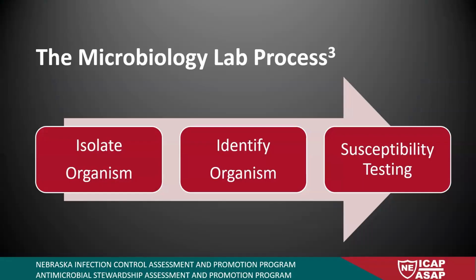So the very first thing I would recommend, if you have a chance, is to go into a microbiology lab, particularly the one that your facility uses, and watch them do it. Spend a day in there. Go and watch them from how they get the sample all the way through how they process it and result the results, because that'll give you such good context as to what you're actually seeing and help you through that process.